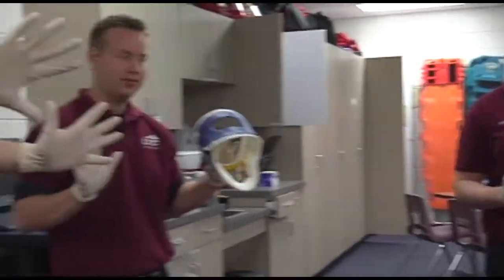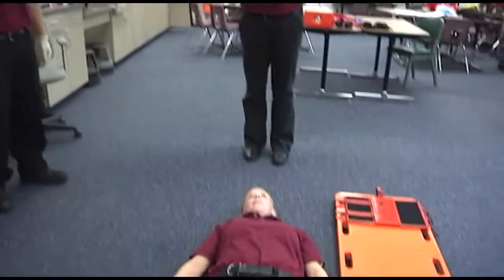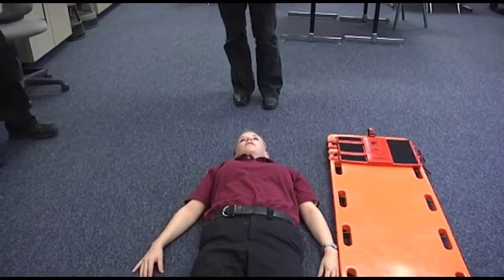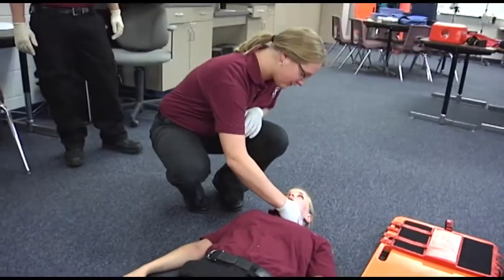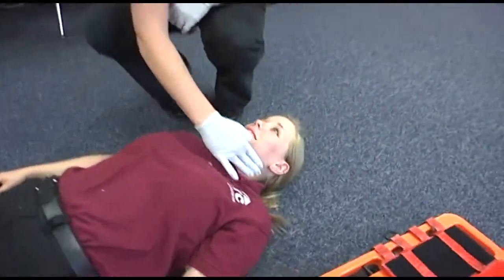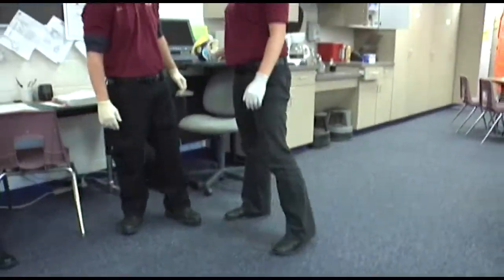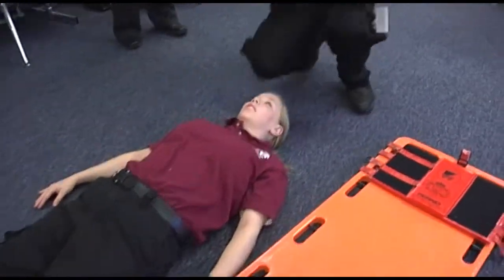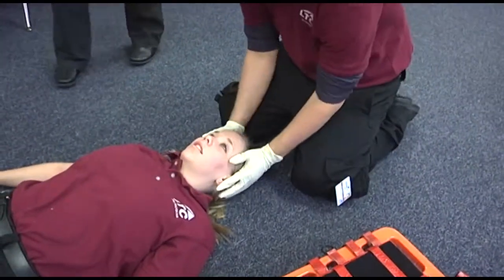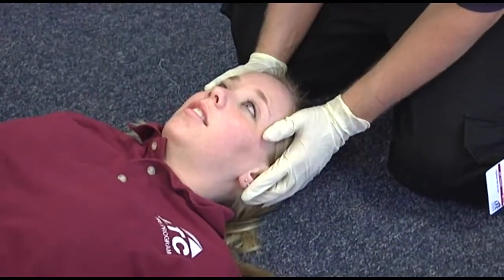Everyone show BSI. Now perform an appropriate assessment — just go down and show that you're assessing the neck. EMT number one will take stabilization of the cervical spine. Beck will take C-spine. Sam, you're going to assess CMS in all the extremities.